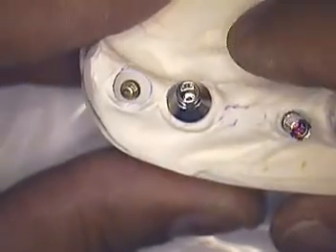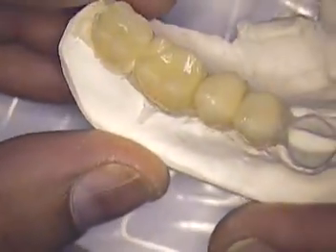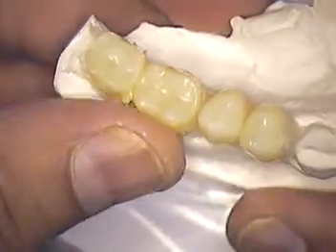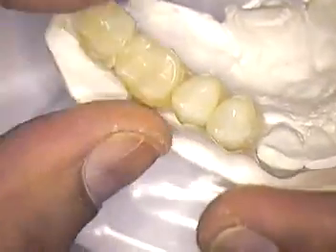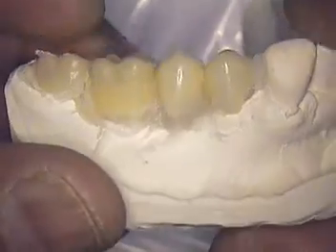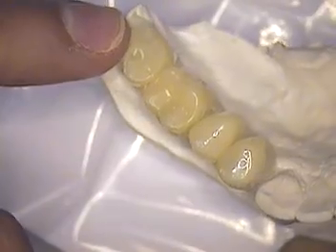Here is a Straumann combination bone level and tissue level implant. Sometimes we have to quickly place some diagnostic teeth over the implants so that we can help the lab technician align the implants in the proper position, especially the vent holes for the screws themselves. What I've done is just taken some ion crowns and placed them in position. Then what we'll do is duplicate this model, which has been mounted to an upper. There's a little bit of a crossbite in this case as we go toward the posterior.